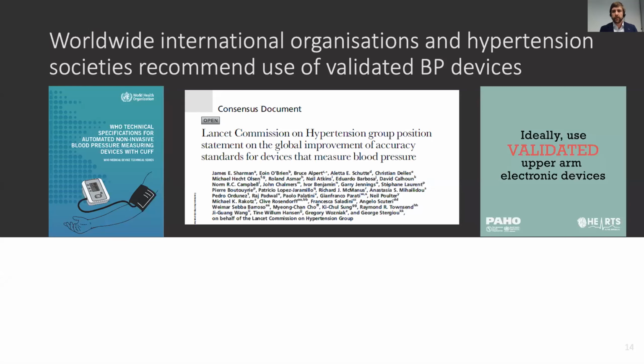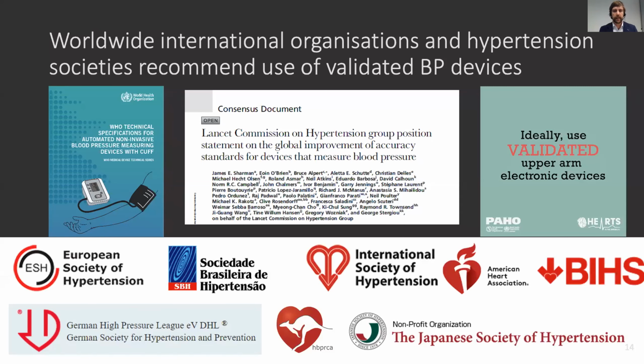And it's really good. We're all on the same page. Worldwide, international organisations recommend the use of validated blood pressure devices. You can see the WHO document, which was published earlier this year, the Lancet Commission Group Position Statement, and the PAHO resource, which is an excellent resource from the website, and the Hearts area on blood pressure measurement. And you can also see, if we click the next button, a whole number of societies from around the world recommend the use of validated devices.